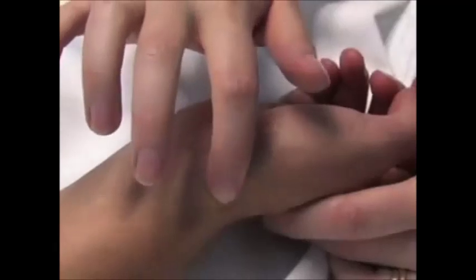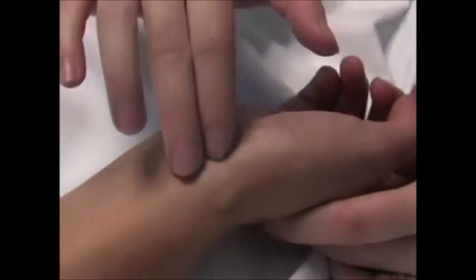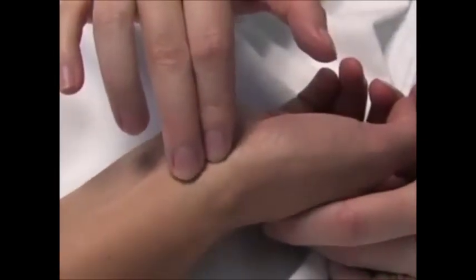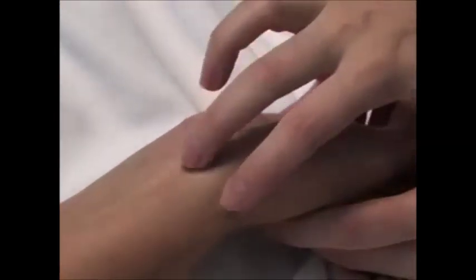First, palpate the styloid process of the radius. Next, palpate the flexor carpi radialis tendon located medial to the styloid process of the radius. Now locate the artery between these 2 points.